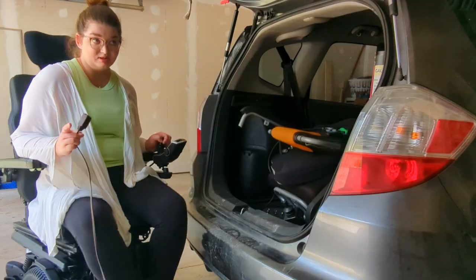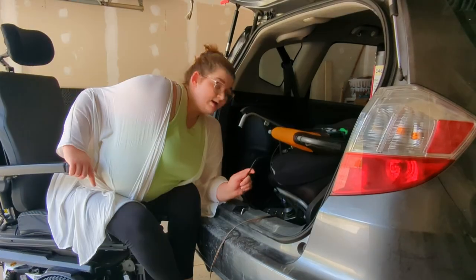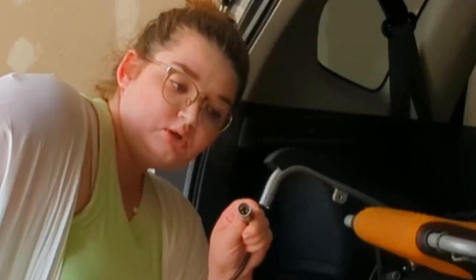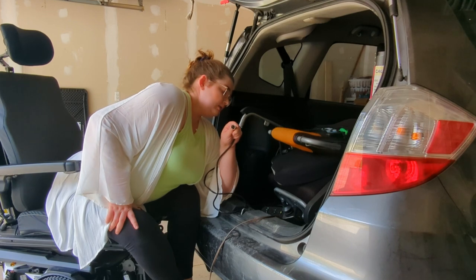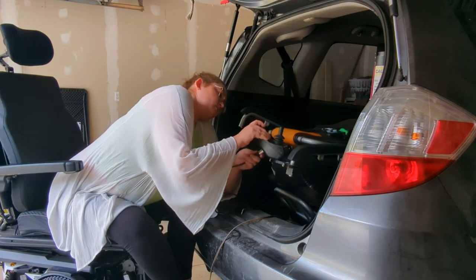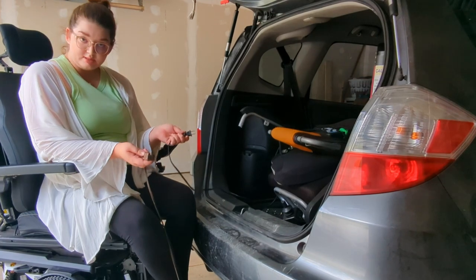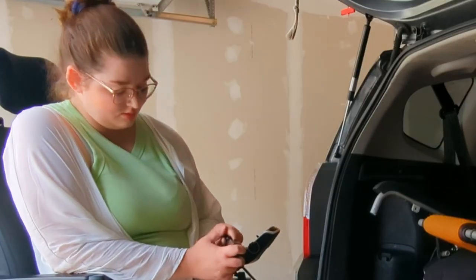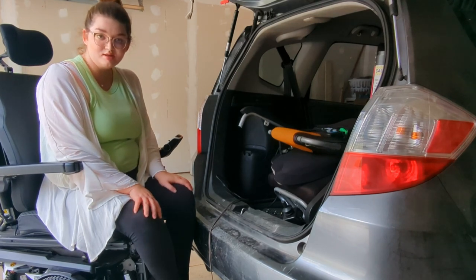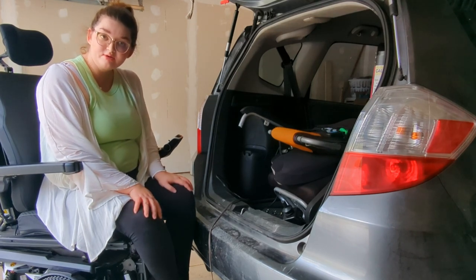The last step is to plug it in so that it's ready for my next adventure. We have an extension cord plugged into the wall in the garage — I keep the charger in my car. It has a little prong that plugs into the bottom of the controller and then into the central cord. A little red light turns on the charger and I know I'm all set to go — it will turn green when the battery is full.